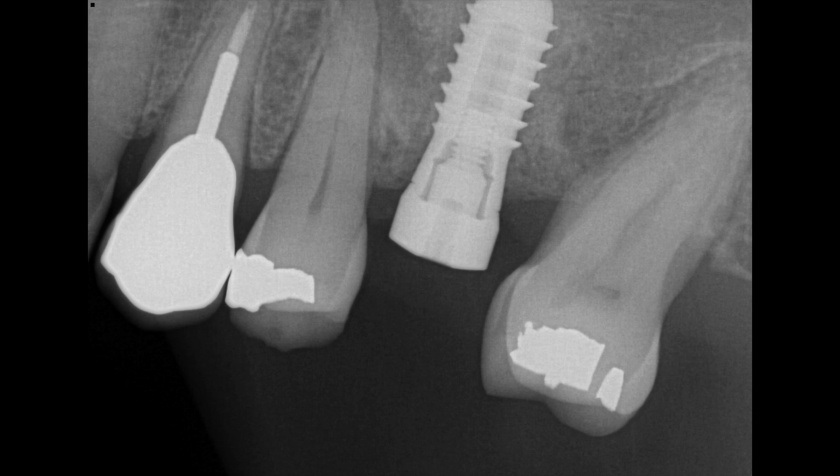We placed a 4.8 by 10 millimeter tissue level into the area. It was pretty thin, but we got a good placement. And from here, we're good to go. So 3 months later, we get the patient back. We take a scan with the scan flag in.